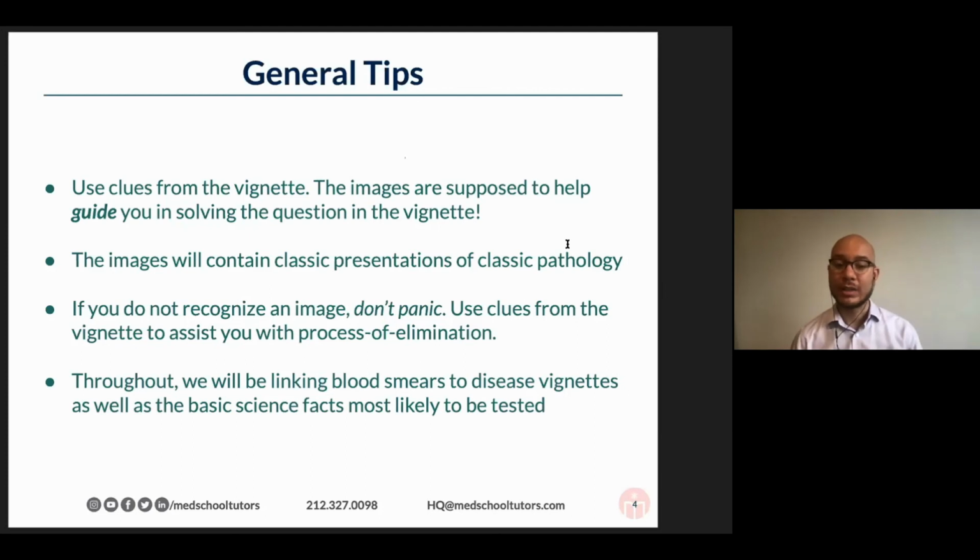And throughout, what I will be hoping to do is to link these blood smears to disease vignettes to give you a sense of what is the illness script, what is the classic presentation for these diseases, as well as highlighting the basic science facts that are most likely to be tested, whether it's going all the way back to biochemistry or some of the subtle treatment decisions that might come up on Step 1 and occasionally on Step 2, as well as the complex examinations.